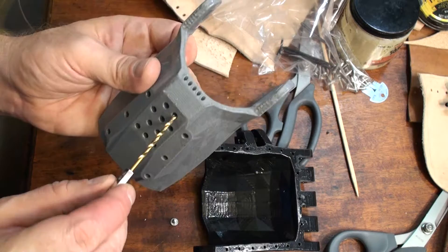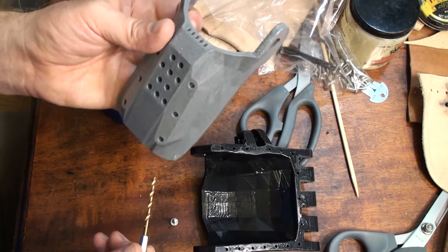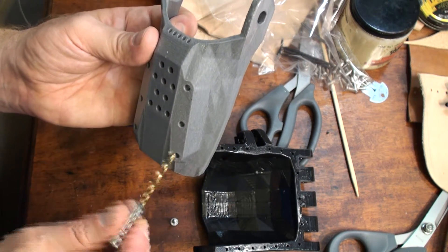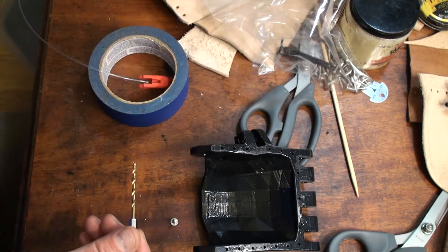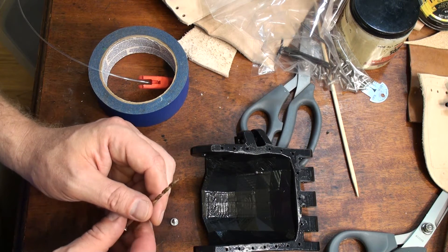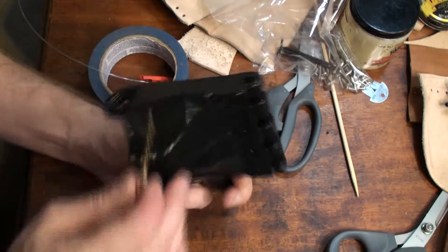When you encounter holes like these that don't go all the way through, you have to be careful not to over-drill. You don't want to drill all the way through the plastic to the other side — that would cause problems. For starters, it really wouldn't look good on the palm.